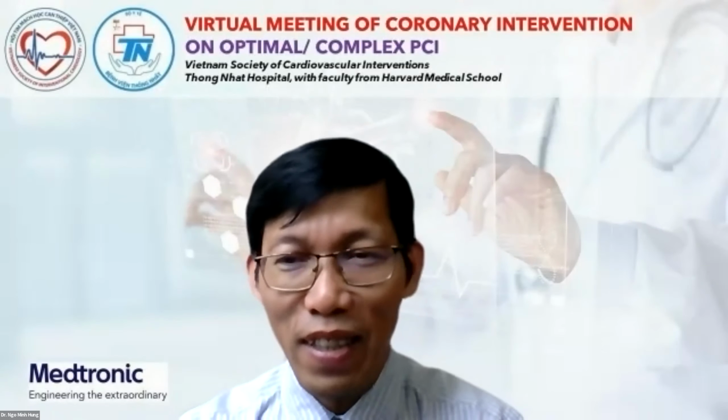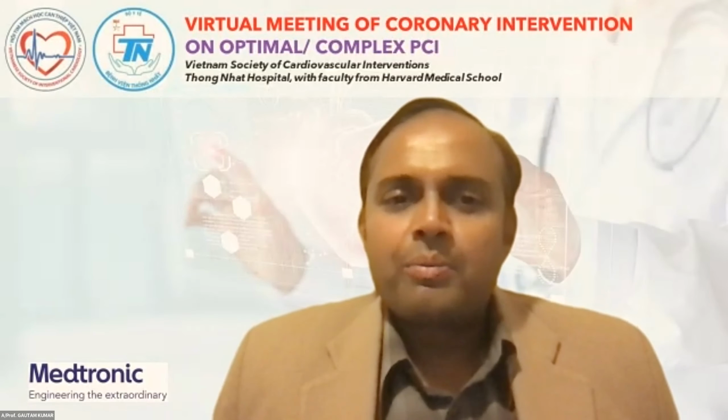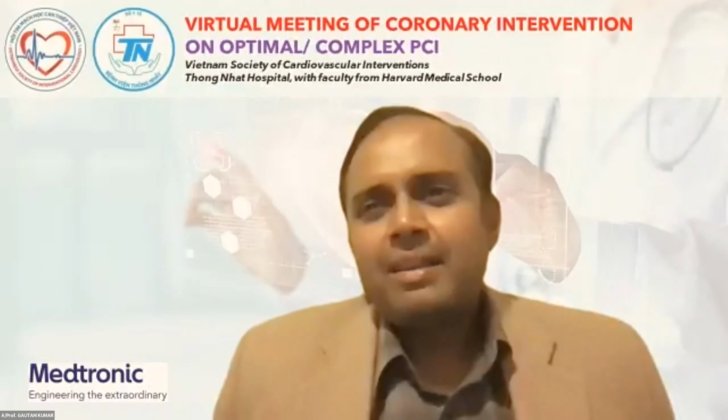Yeah. It is tricky. It is not always straightforward to see and do IVUS guided puncture. I think Dr. Hung is absolutely correct that it will require an 8 French guide to fit all that equipment in there. And that does make the procedure more complicated. Access is more problematic. It does make things more difficult. But I think there are cases where IVUS guided puncture can be of value. We have done several cases where without IVUS guided puncture, we would have been totally in the wrong area.